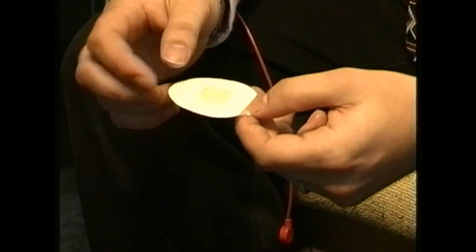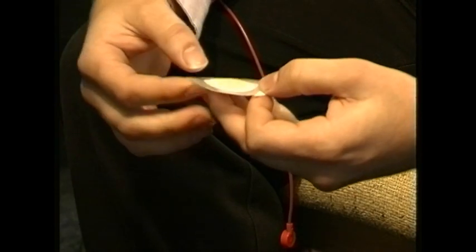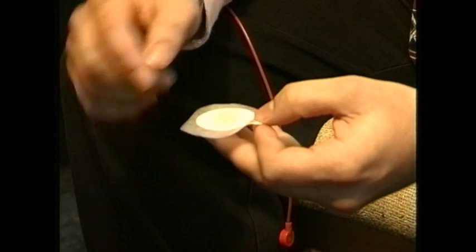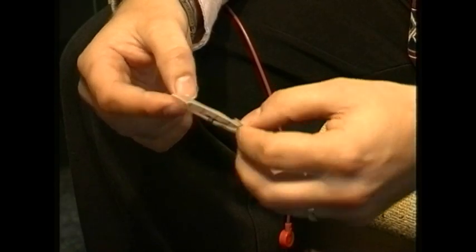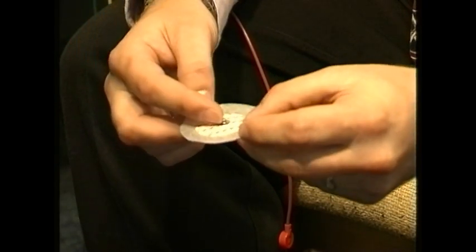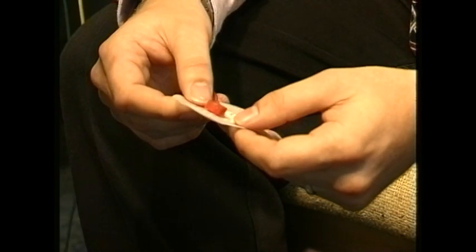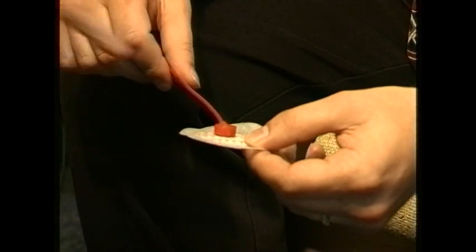What we need to do is attach you to the monitor with these ECG electrodes. Here we have the ECG electrode. There's an outer protective cover that we peel back. We have an outer sticky surface which will attach to the skin, and an electrode gel with conducting gel to conduct the impulse. On the other side, we have a stud which is then attached to the ECG monitor. So the electric current goes from the chest through the gel into the stud and then back along the wire to the equipment.